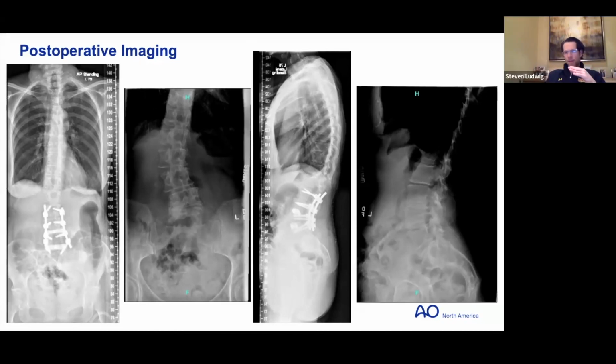Yeah. Some of the people that are championing this will tell you that having a contralateral bolster to prevent the patient from moving, the cage from bouncing back, and the retractor shifting out is important. And I think you brought that up. Even tilting the patient obliquely so that you're working at a better angle from an ergonomic standpoint, and getting your surgical working zone and orientation a little bit better oriented. I think the teaching purposes that you brought up are really important.